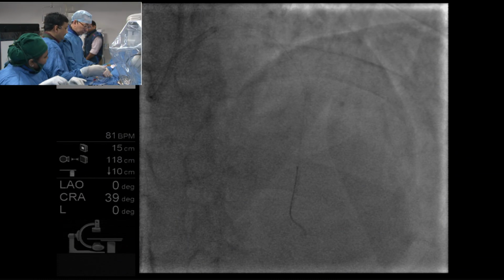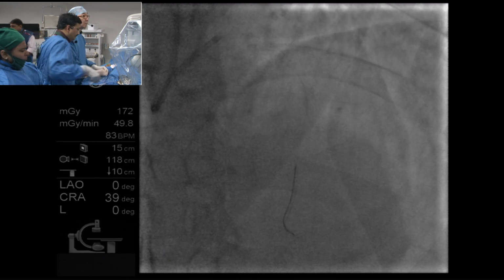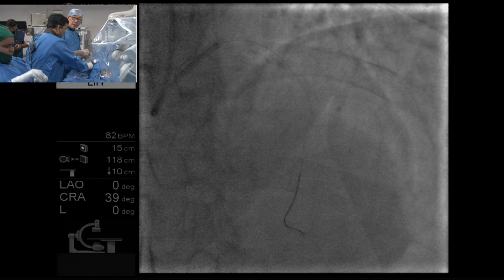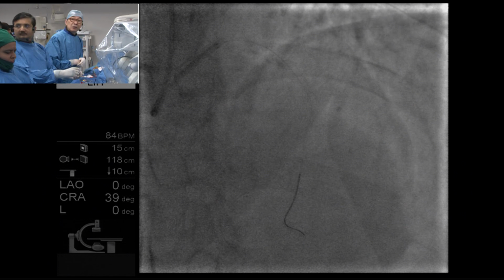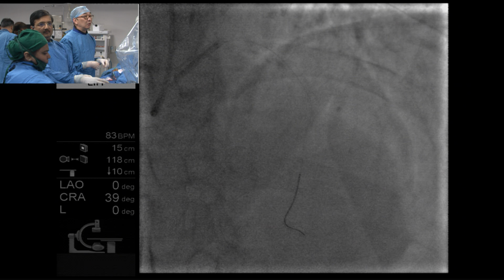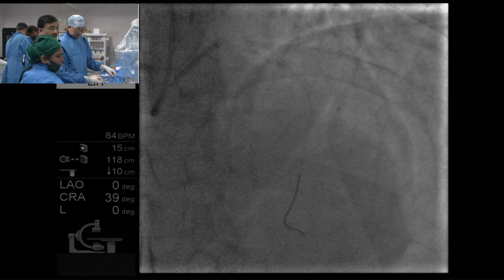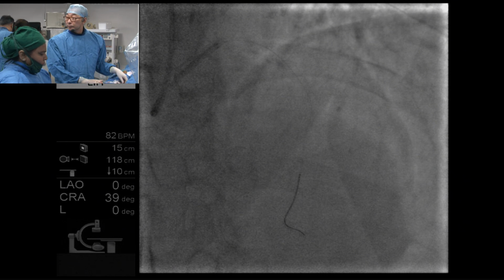A lot of proximal calcium, was it a concern for us? Yeah, some proximal calcium, but it's not severe by IVUS. And the luminal area is very good. I don't intend to cover all the way to the proximal. That's another issue with IVUS.